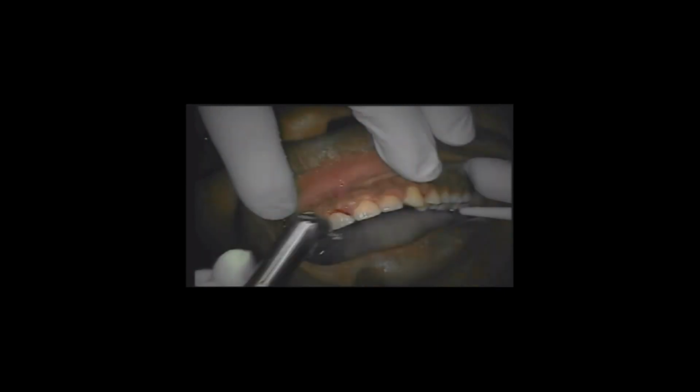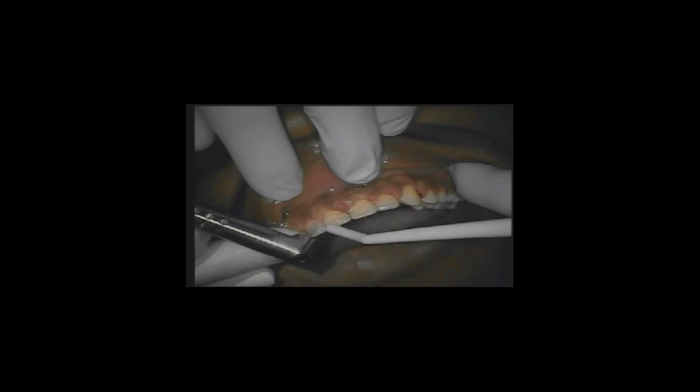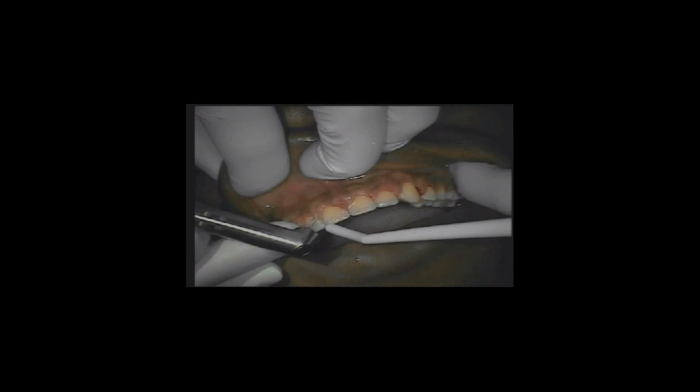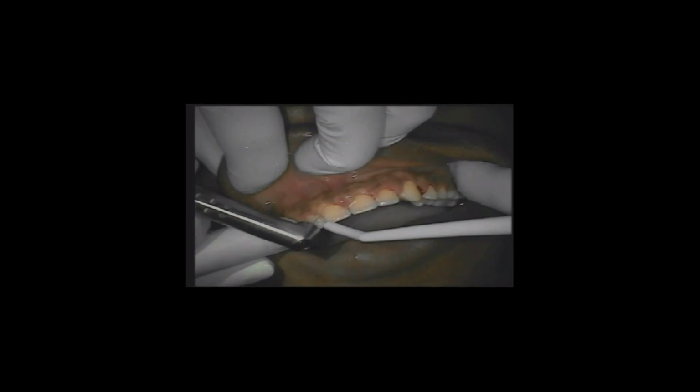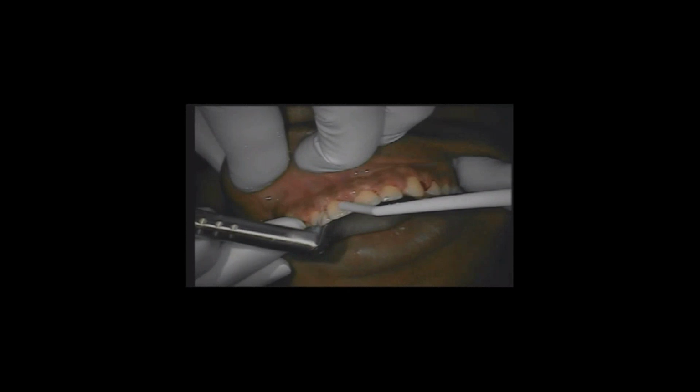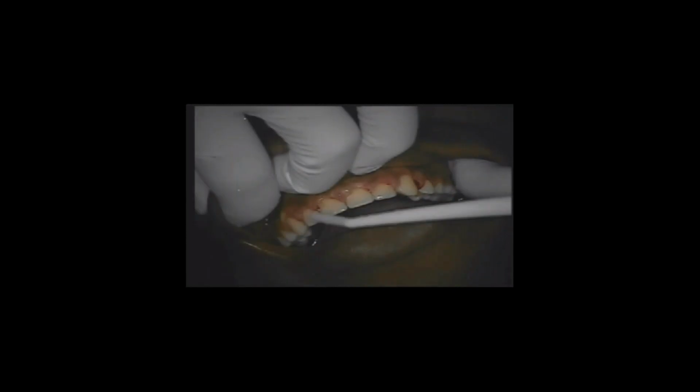But I'm more perpendicular, just trying to excise a larger volume of tissue, particularly in the interproximal areas. You can kind of see that piece of tissue that is coming off in one big section.